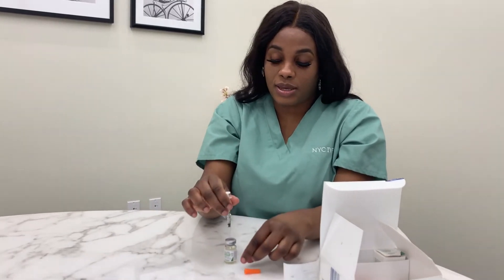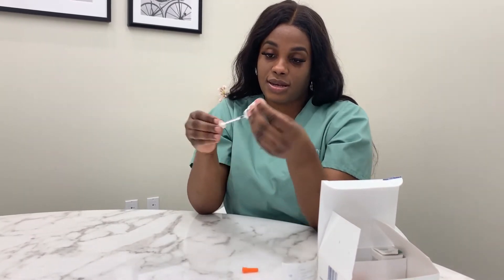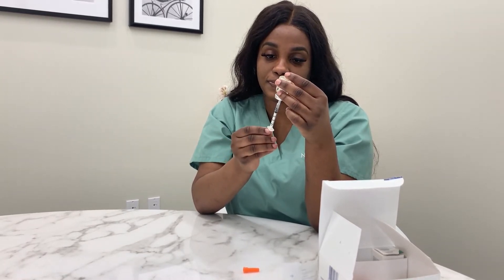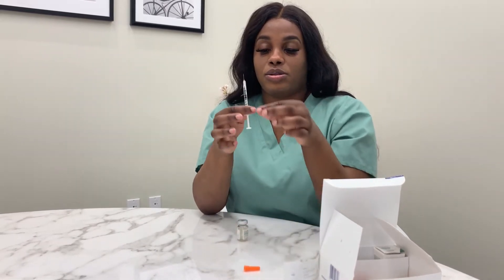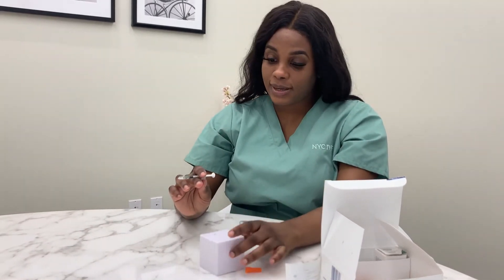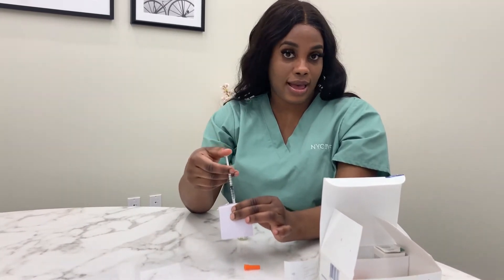For a trigger shot, we do 20 units of Lupron. You would insert the needle into the bottle and pull it to 20 units. This is 20 units of Lupron. You inject it subcutaneously — you would squeeze the fat on your stomach, insert the full needle, and press.